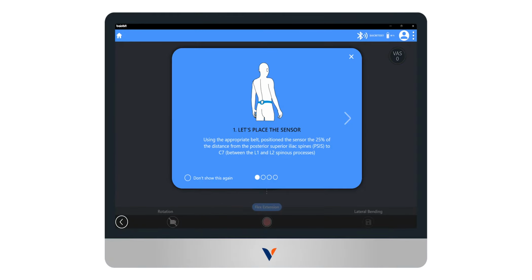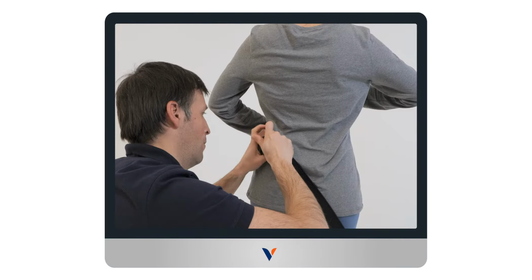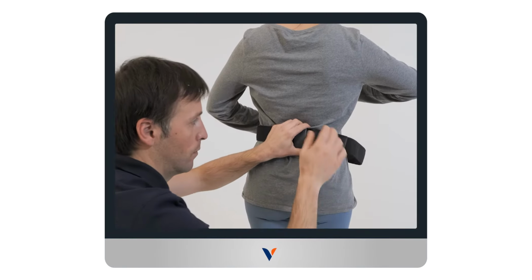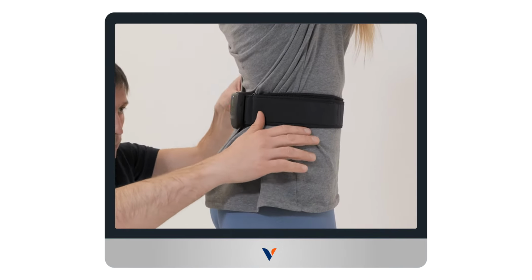As shown by the pop-up, to obtain reliable and repeatable data during the execution of the test, it is necessary to correctly position the sensor on the subject to be evaluated. For the trunk test, the sensor must be hooked to the appropriate band and securely placed at 25% of the distance from the posterior superior iliac spine to C7, between L1 and L2 spinous processes.